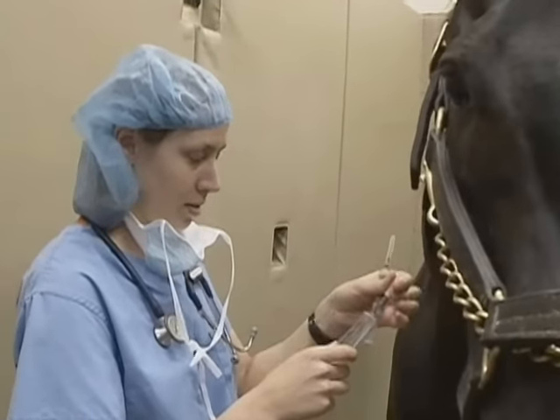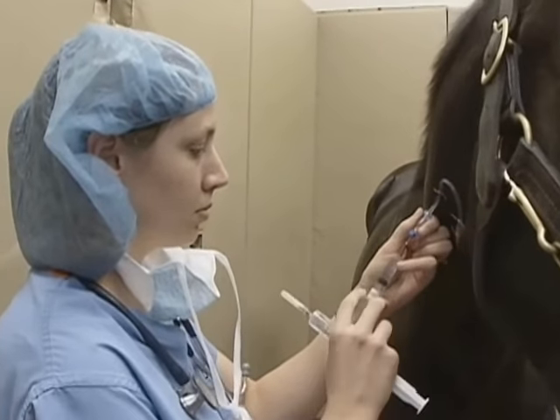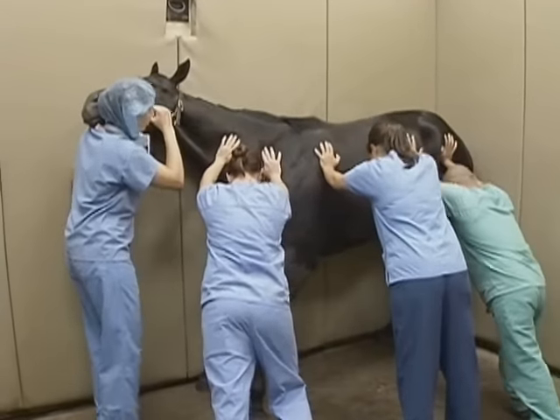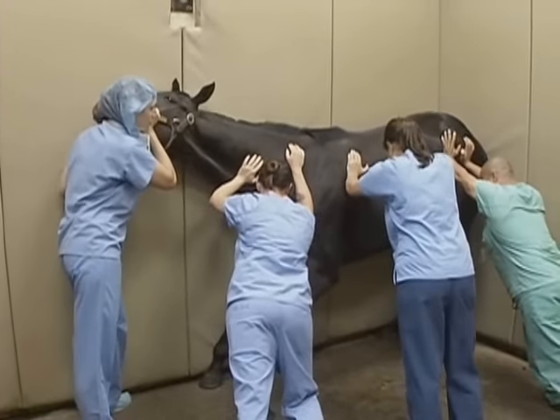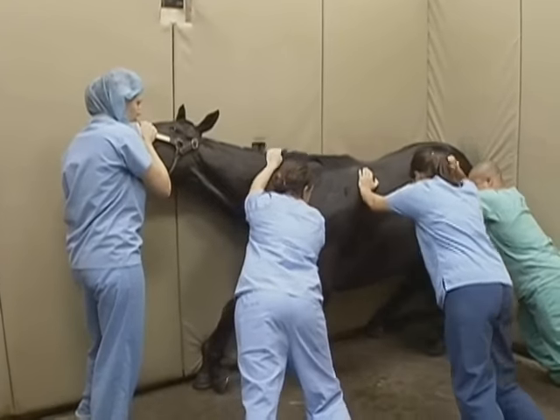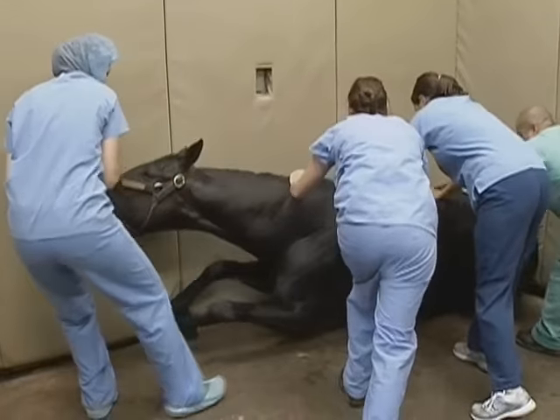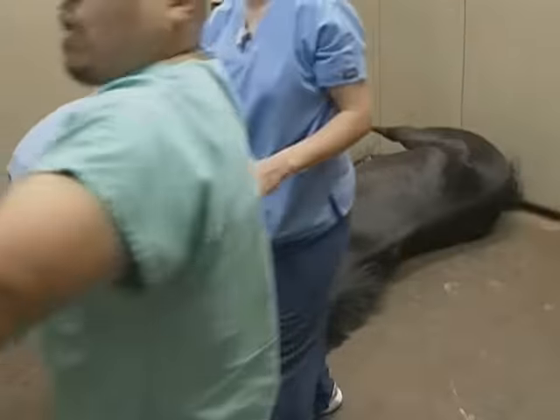The horse is brought into the induction stall. Once the horse is properly sedated, then they're given the induction drug. For the induction of anesthesia, there are several personnel, and this is for two reasons. One is to make sure that the horse safely drops to the ground so we can put some gentle pressure against the horse's side so he can just fall against the wall. The other reason is to protect the people inducing the anesthesia, because the horse is a big animal, sometimes weighing up to 1,800 to 2,000 pounds.